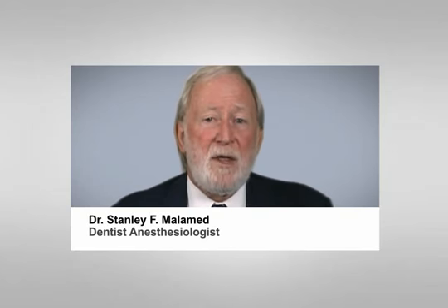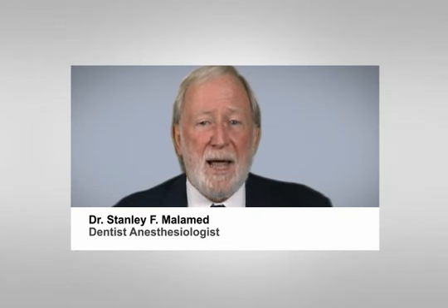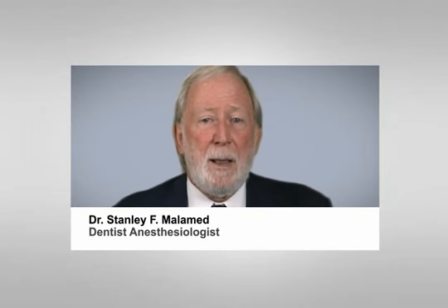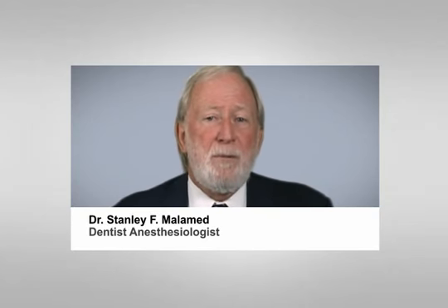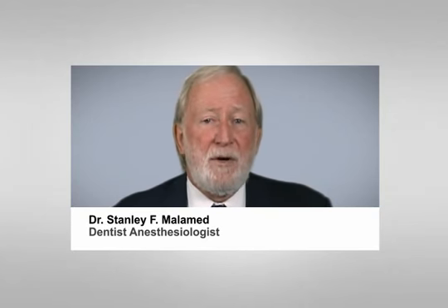The palatal anterior superior alveolar nerve block is an easily administered injection that allows the operator to achieve bilateral anesthesia of the maxillary incisors and canines from a single palatal injection. The PASA is an excellent alternative to administering multiple buccal infiltrations in a highly sensitive premaxillary region of the mouth when you need to achieve pulpal anesthesia to the 6 anterior teeth. Let's discuss how to begin.